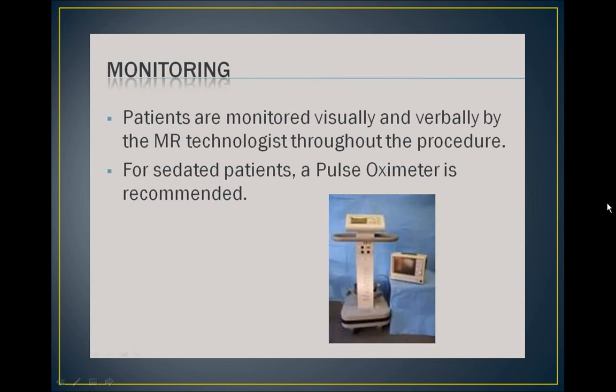The technologist should constantly monitor the patient through a scan view window and the intercom system. They should be given an emergency call button and instructed how to use it if an emergency arises and they need to be removed out of the scanner quickly.